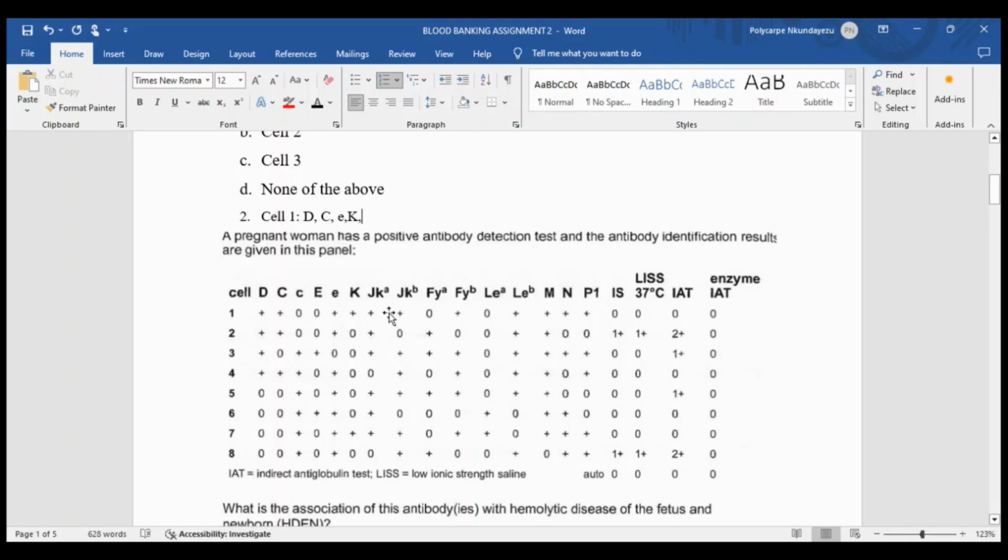This is not. Okay. What about this one? This one is Kidd. We can't remove them, right? Yeah. It's better to explain to us because we don't know why we are skipping them. Now, okay, we are now removing the Fy b, right?